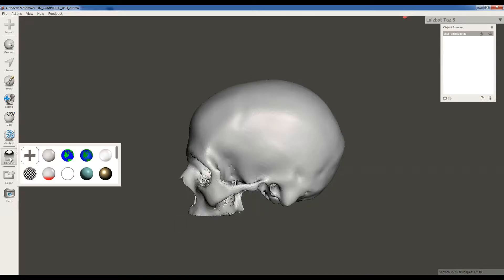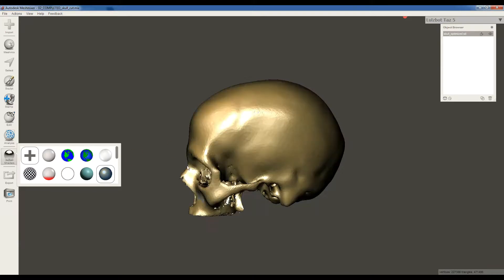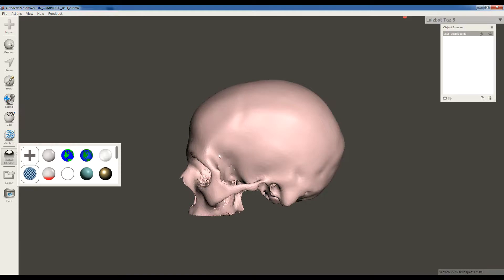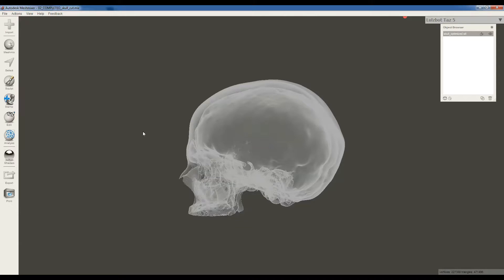The first thing that's helpful is to make this skull transparent and the way you do that is with shaders. If you click on the shaders button, you can see you have a lot of different options here. We could make it gold, we could make it pink. I'm going to grab this transparent looking ball and make the skull transparent. That will be easier to work with at this point.